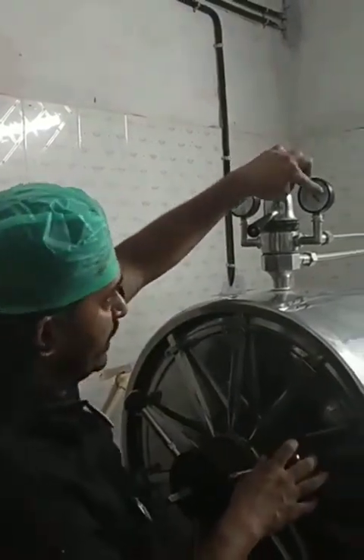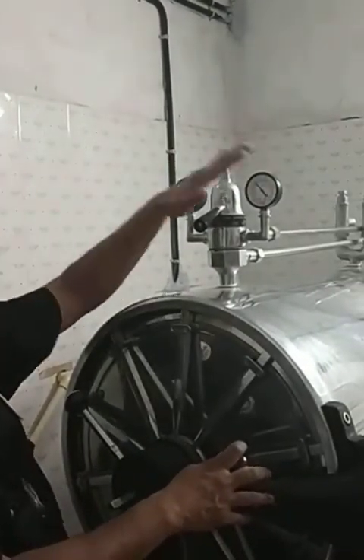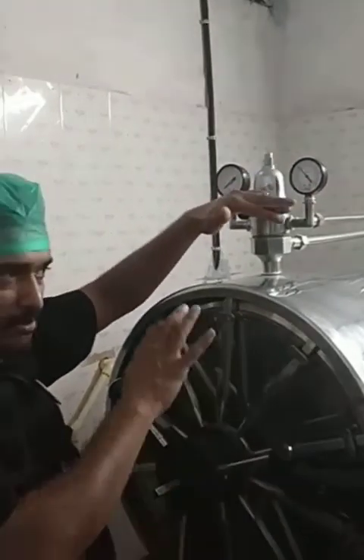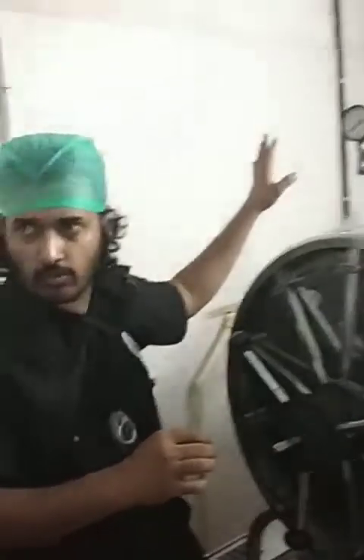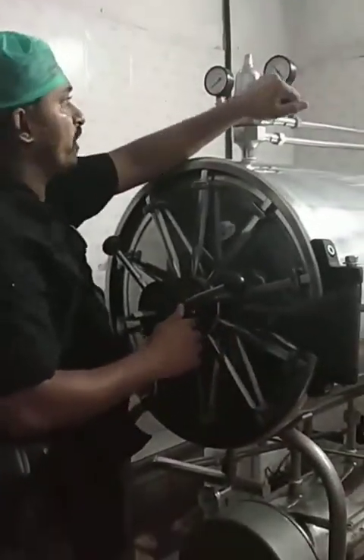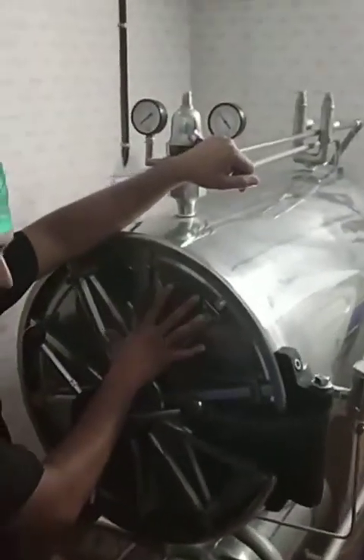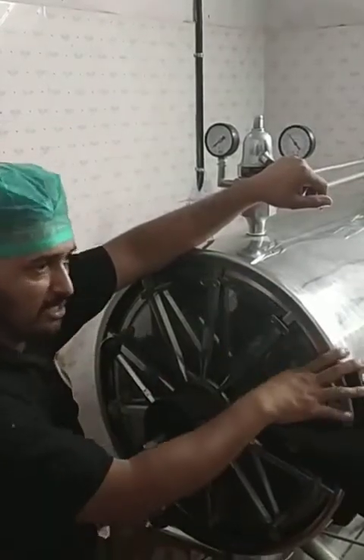Once that 15 to 20 psi has been reached, from that time we start counting. Once 30 minutes is over, we switch off the power supply so that no more heating occurs. After that, we do a fast exhaust — that means all the steam inside will be removed from this section and sent outside.